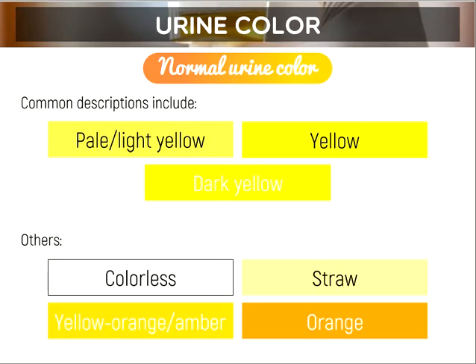Guys, the physical part of the urine usually depends on the medtech. It varies per medtech. For example, my reading of the urine color is yellow, but my partner's reading is pale or light yellow. So it is not objective, so to speak.